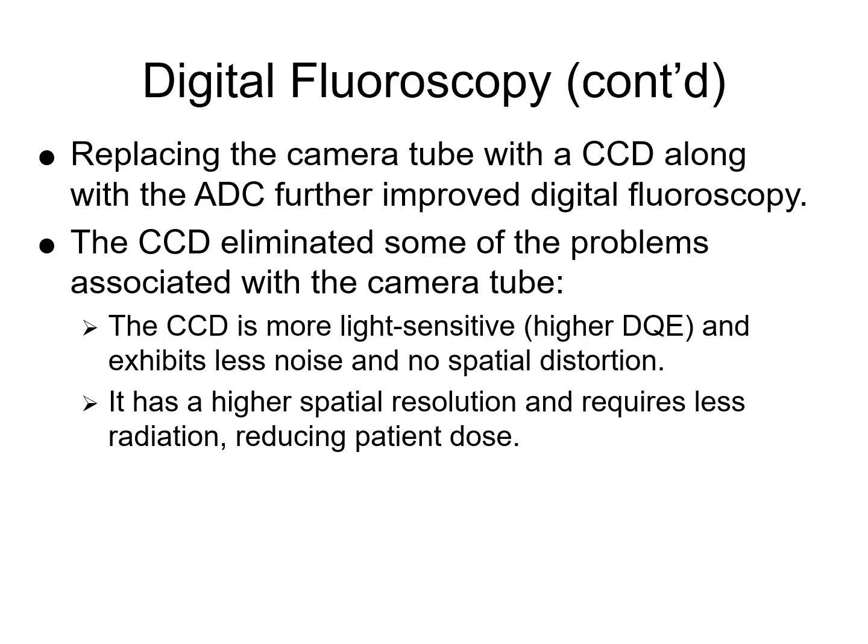All right, so a conventional camera basically captures light and is able to transmit it to a broadcast monitor. Back in the day, that was a cathode ray tube. In the modern era, that is an LCD monitor. Okay. So the CCD, which debuted somewhere in the early 70s, started replacing the camera tube because the CCD is actually a more efficient camera than a conventional motion picture camera tube, which is called the Plumbicon or the Vidicon.